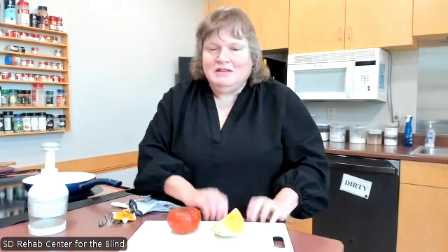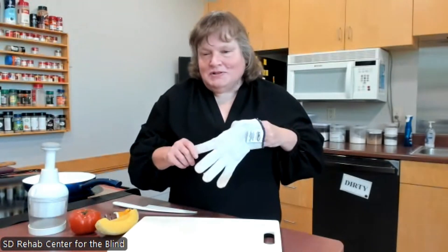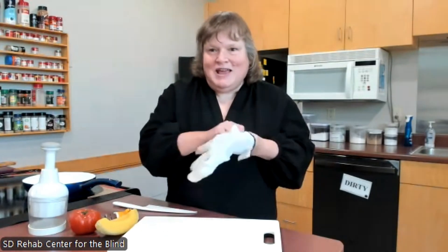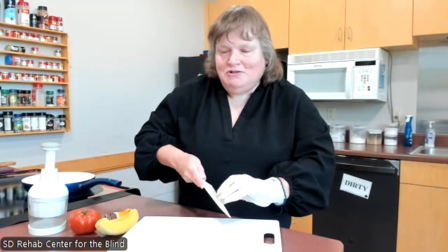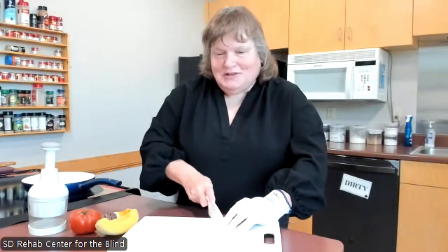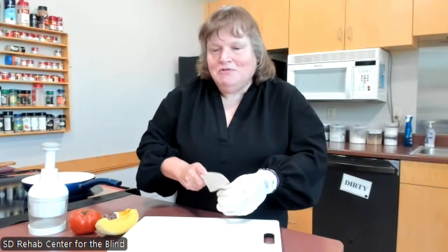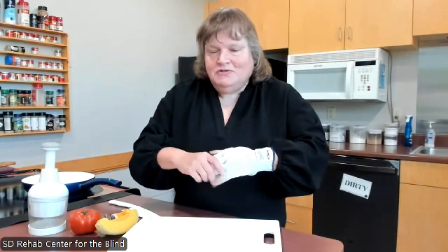All of my students who have low vision love this cutting board. The next thing is the cutting glove. I was really excited to find that they actually do have cutting gloves. You just put it on your hand, and then if you're cutting, you can still hold your food and cut without worrying about your fingers getting hurt. I don't think you can cut through it — I never have, and I've had these for years. They also remove the fear that you're going to get your fingers cut. They come in medium and large sizes.